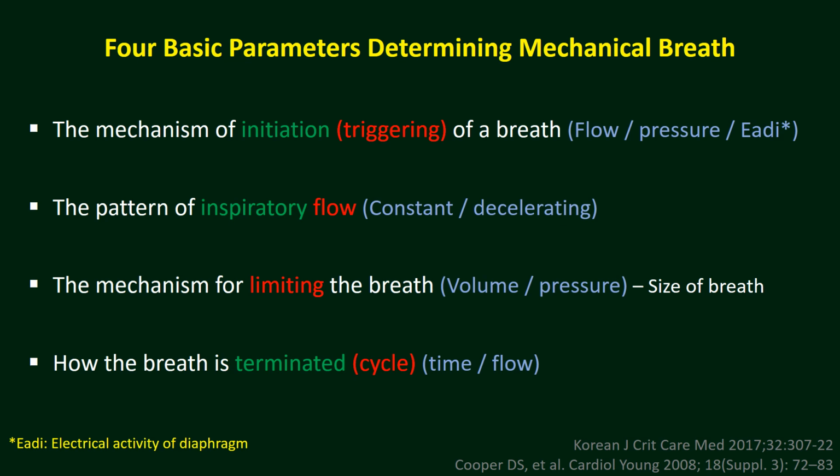Second is flow. When a breath is triggered, the ventilator will deliver a breath inside the lung, and how the flow will be entering into the lung to expand it, whether it will be constant flow or decelerating flow.